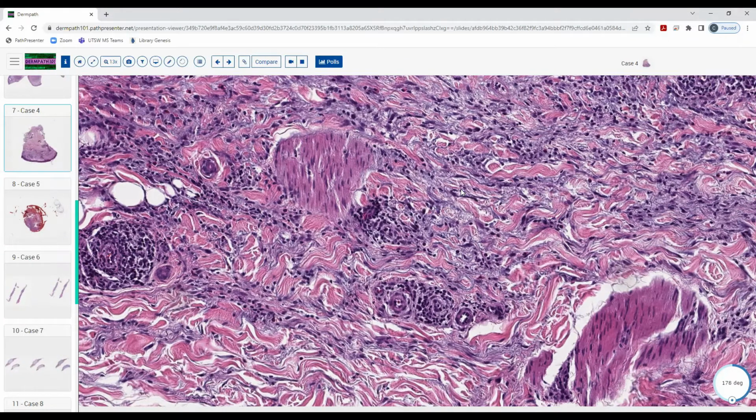Like a sarcoma, like an epithelioid sarcoma. Good, very good. That's the one that you need to always remember. Never forget that, because it can look like GA, and sometimes even clinically it can look like dermal papules, usually on the arm of a young person. Epithelioid sarcoma is one of the most common soft tissue sarcomas in young people, in their teens, early 20s, 30s. Sometimes it gets missed and gets called GA, and then the diagnosis is delayed and it results in a problem.